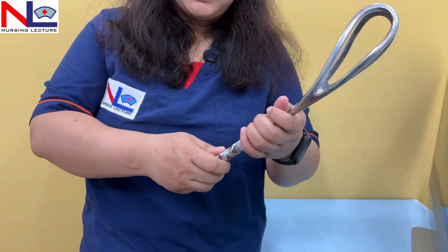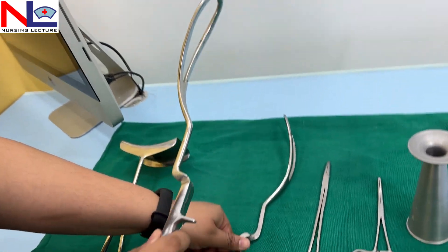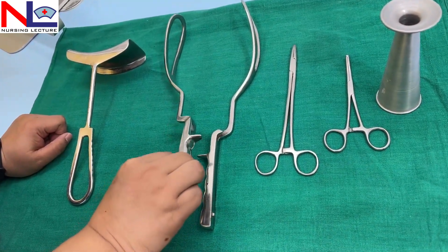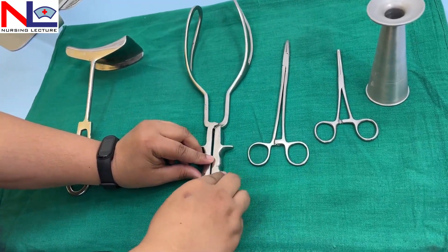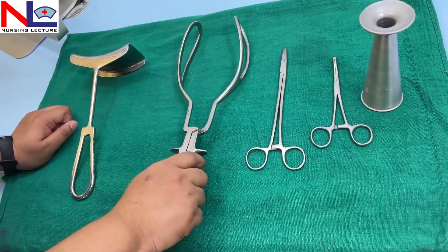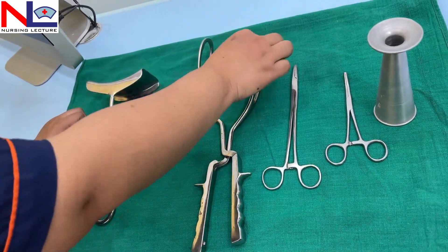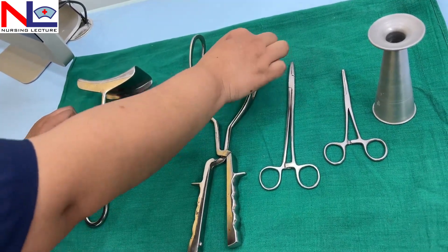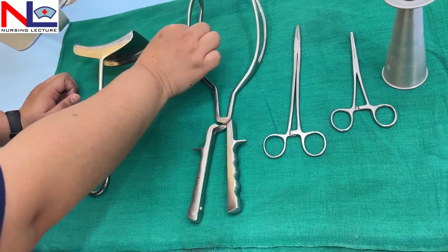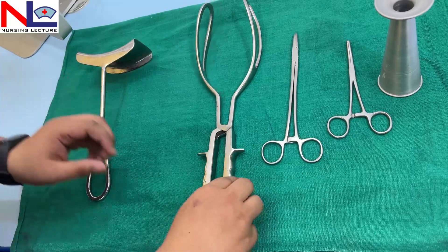The shanks are parallel to each other, and here is the lock and the finger guard to keep our fingers on the handle. Whenever a student is asked to identify the left and right blade, you have to keep the blades in an upright position and place them on the table, then fix them together. Once the lock engages properly it means you have placed the blades correctly. The blade that comes in relation with the mother's left side is the left blade, and the blade that comes in relation with the mother's right side is the right blade.